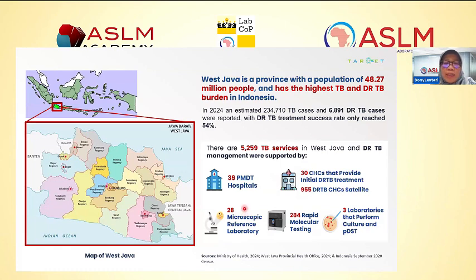We also have 28 microscopic reference laboratories. And then we also have around 284 Xpert machines and 3 laboratories that can perform culture and phenotypic DST.